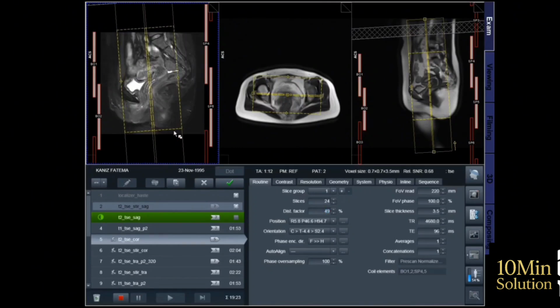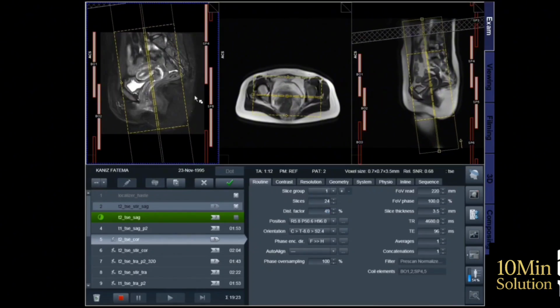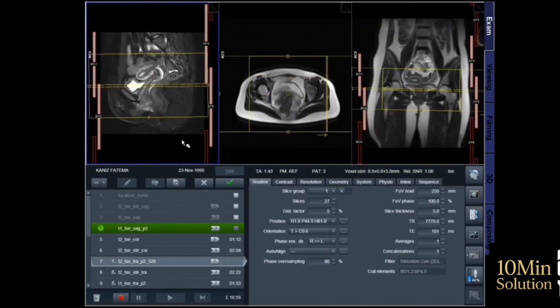Let's increase the distance a little. Following the anatomical position, we have nicely set the coronal plan. Okay, now on to another plan. One axial, so the axial plan will be coronal and above the sagittal. We have followed the anatomical position and set the planning very nicely.